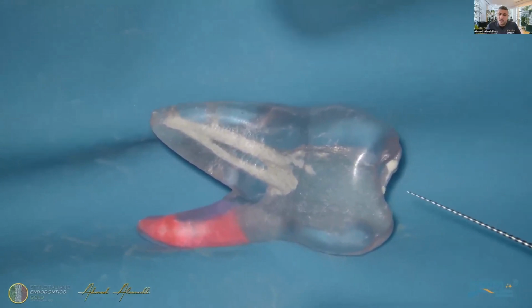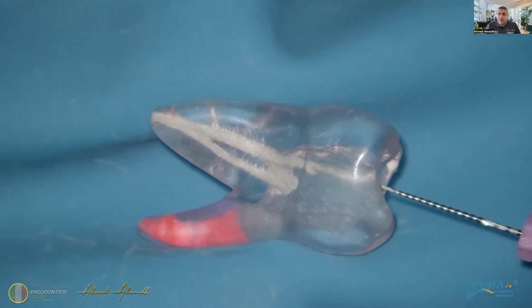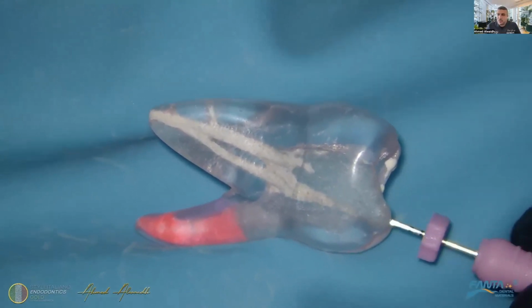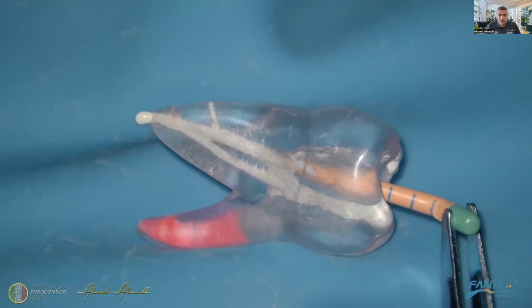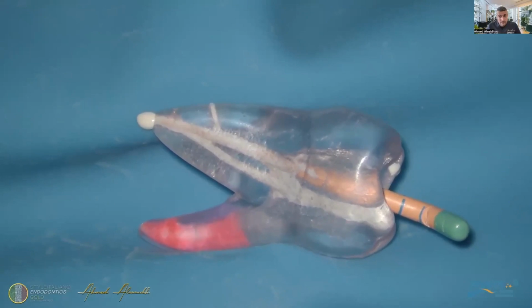Okay, we introduce our hydraulic cement, then we distribute it with a K file, and then we will use our master cone or accessory cones to distribute the material. As you can see in this video here, we have a lateral canal being filled with the hydraulic cement. Again, it's not a sealer. This is a filling material.